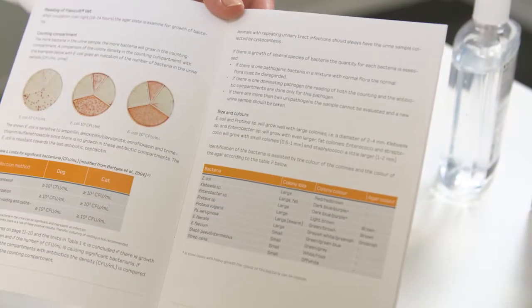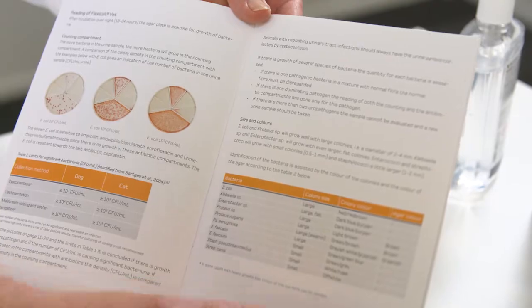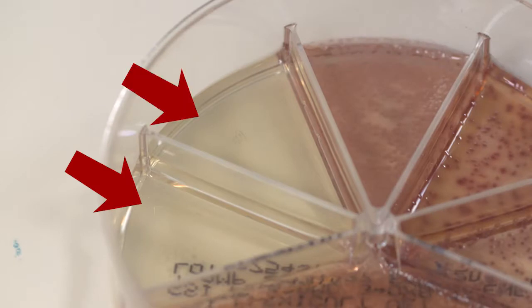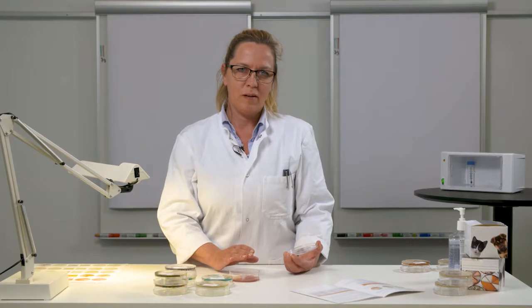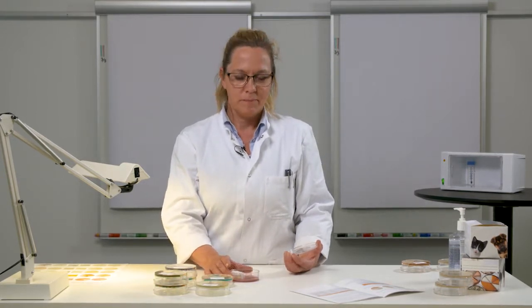Again, when reading the plates, it's crucial to use the manufacturer's information insert. In this example of E. coli, there are 2 compartments with no growth, indicating that the bacteria are sensitive to this antibiotic, and 3 compartments with growth, indicating that the bacteria are resistant to these. It's important to evaluate bacteria density in the counting compartment and the antibiotics compartment. They must coincide.